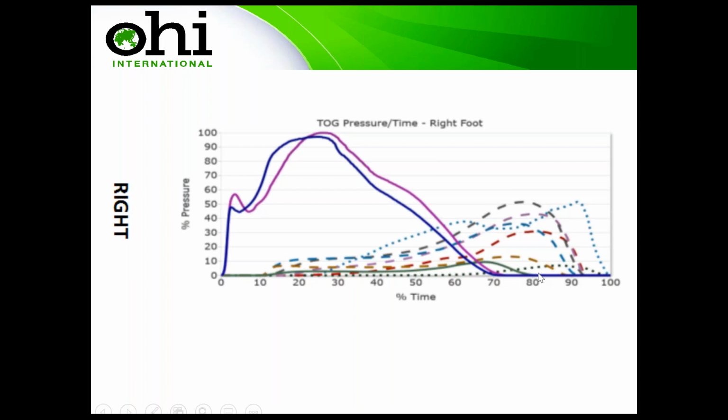So what we have got is a case where the forefoot's got down really quick, the heel's stuck, probably because the foot has collapsed internally, and it then has to externally rotate, and as it externally rotates to move off, the heel is still stuck to the ground. But this is going to increase the stress through the Achilles. So again, you see that in a patient who's coming into you, either if they're having a pre-medical and they're wanting advice on what running shoes to wear, straight away you would be looking at that and saying, you know what, your Achilles is under a lot of stress.